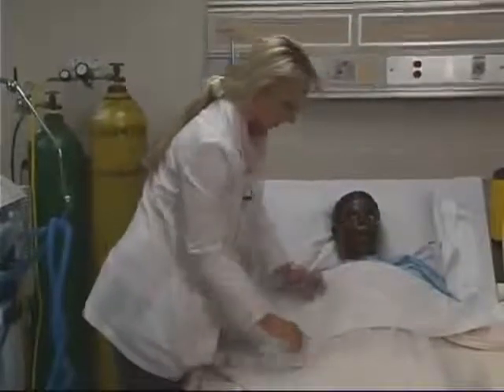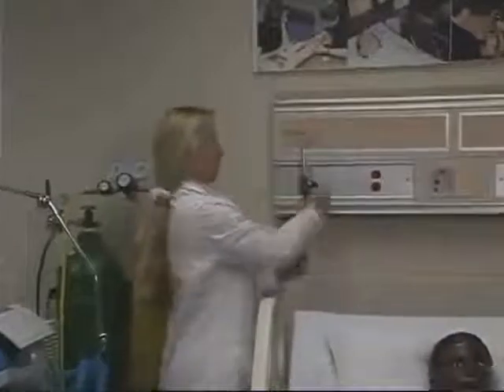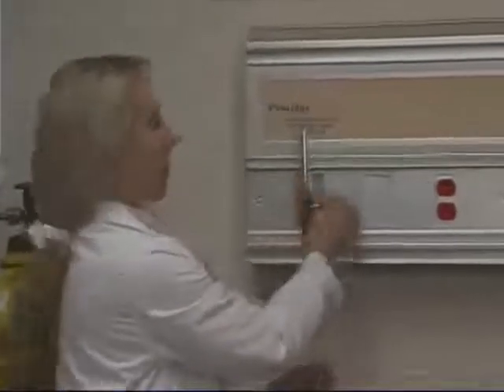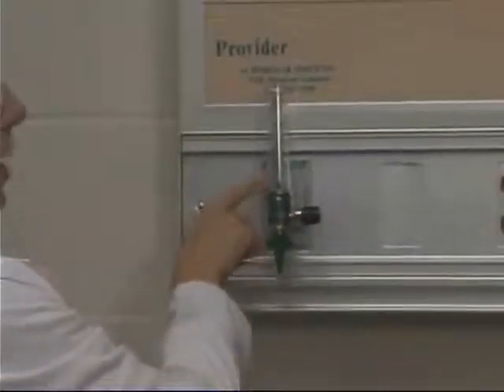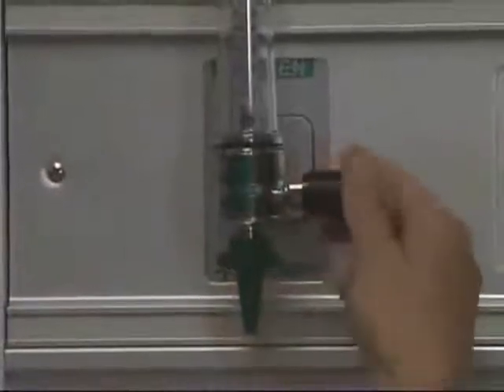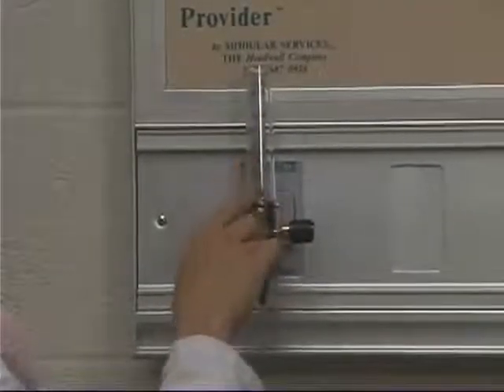Once it's on the patient, this end gets attached to the source of oxygen which will be on the wall. This knob will turn the oxygen on or off. If you turn this to the right, there is a black ball in here and this will rise. If you can see the numbers, it goes from 1 up to 15 on this flow meter. As you turn this, you can adjust where this ball rises and you need to set this according to the order as far as how much oxygen you're going to deliver to the patient.